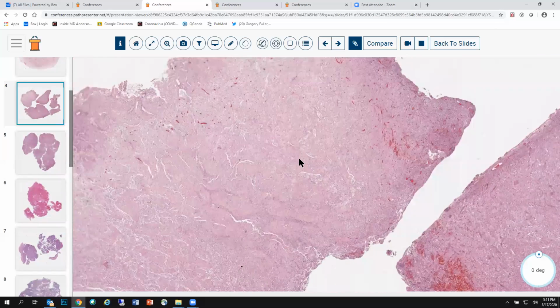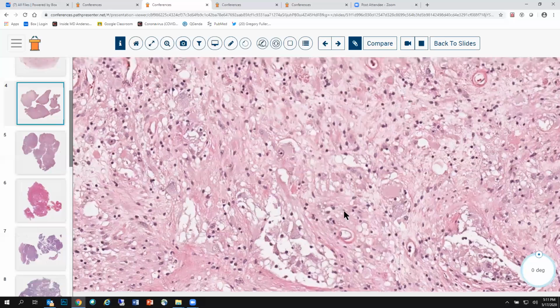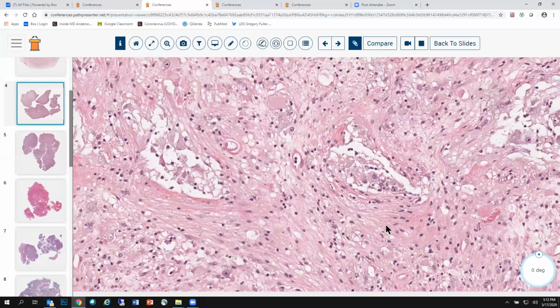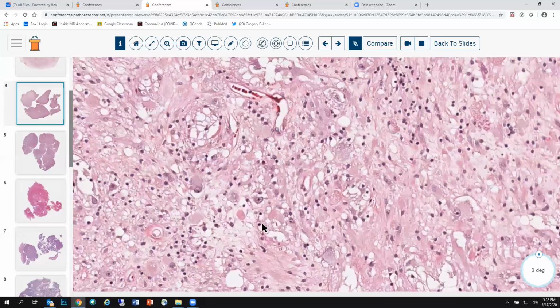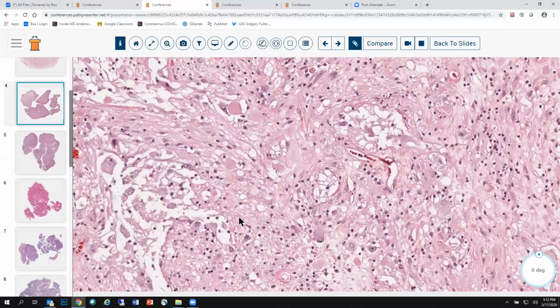Multiple fragments of tissue, going up to higher power. And the first 2 things are catching your eye. Let's just stay right on this field. The first thing is you see spindle-shaped areas. Those spindle-shaped areas look a little bit like pilocytic astrocytoma, elongated bipolar cytoplasmic processes, and interspersed between these elongated glial cells are nests, like here and here, of other cells that have, let's go up to higher power. There we go. Prominent nucleoli, a copious cytoplasm, Nissl substance. These are clear ganglion cells.